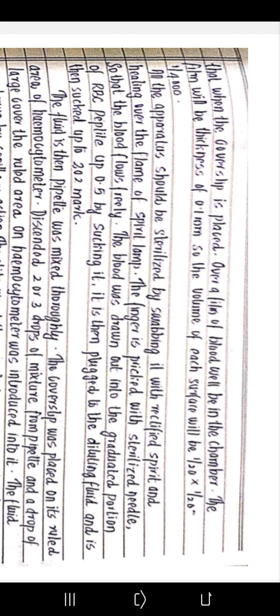The apparatus should be sterilized. The finger is pricked with a sterilized needle so that blood flows freely. The blood was drawn out into the graduated portion of the RBC pipette up to 0.5 by sucking it. It is then plunged into the diluting fluid and sucked up to the 101 mark. The fluid in the pipette was mixed thoroughly.